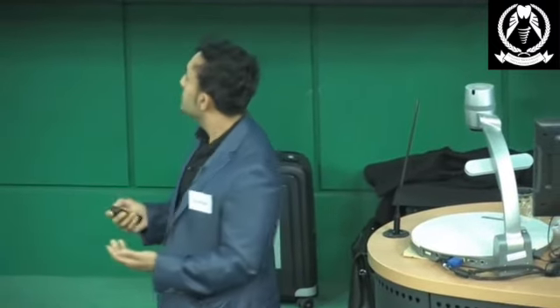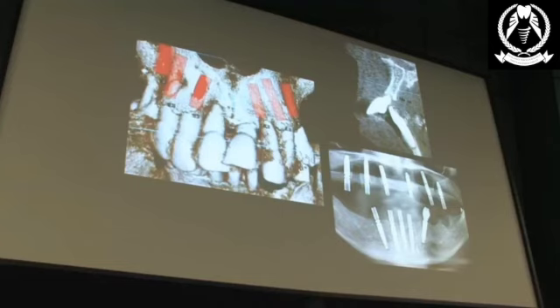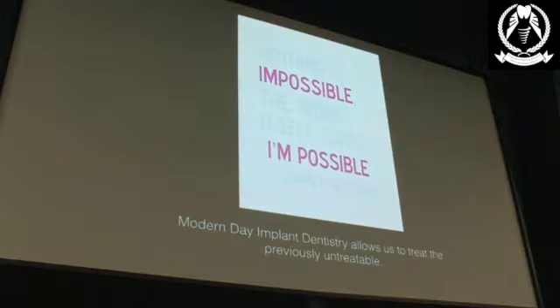It's another example of what I do and the kind of patients that approach me with really failing teeth, bad perio, lack of bone, being told they need full dentures. Specifically because my interest is in immediate loading, giving them teeth in one day, and some of the patients we're developing and grafting bone at the same time. So this is just another case example for you.